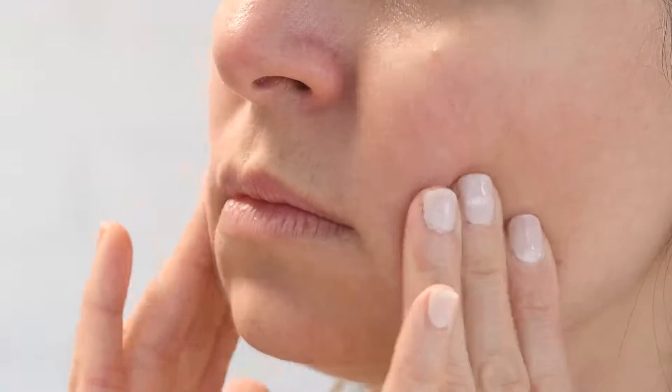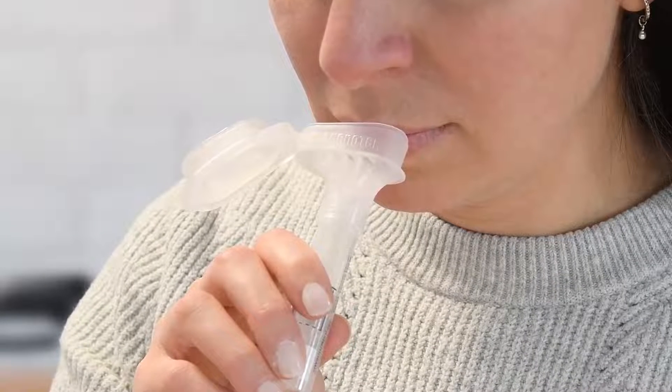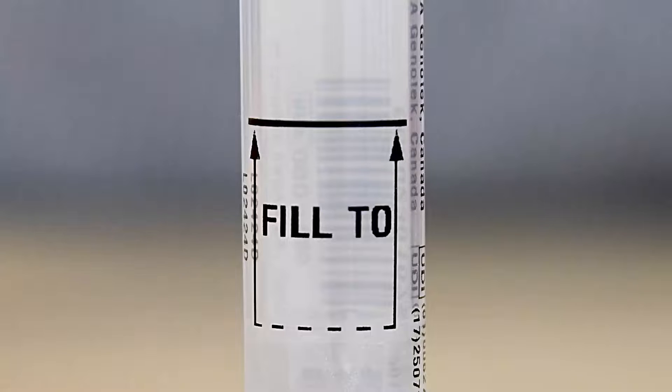Before spitting, relax and rub your cheeks gently for 30 seconds to create saliva. Place the top of the funnel close to your bottom lip and start delivering your saliva sample by spitting into the funnel. Some people will have bubbles or foam in their saliva.